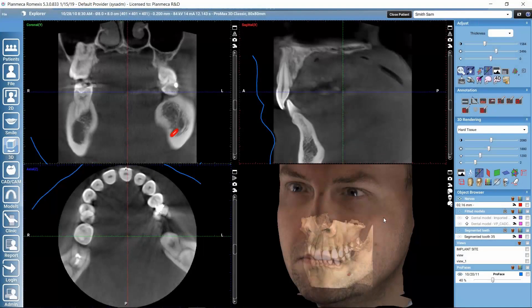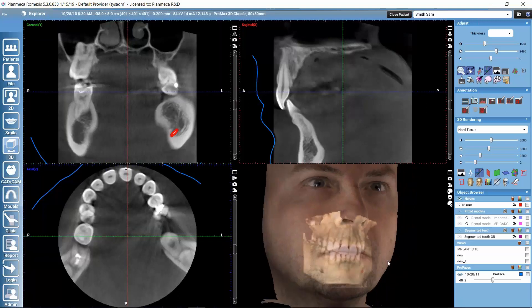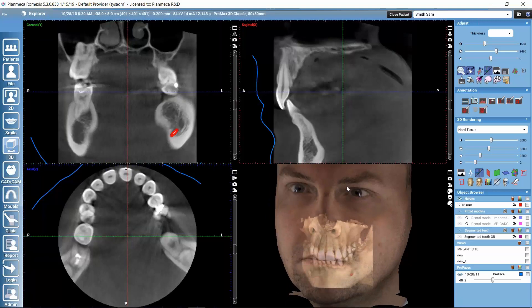In this tutorial we will focus on the 3D rendered view in the 3D imaging module of PlanMeca Romexis software. In most of our 3D imaging submodules, besides the slice views that represent the actual data, we also have this 3D rendered view that is a nice 3D visualization of the data.